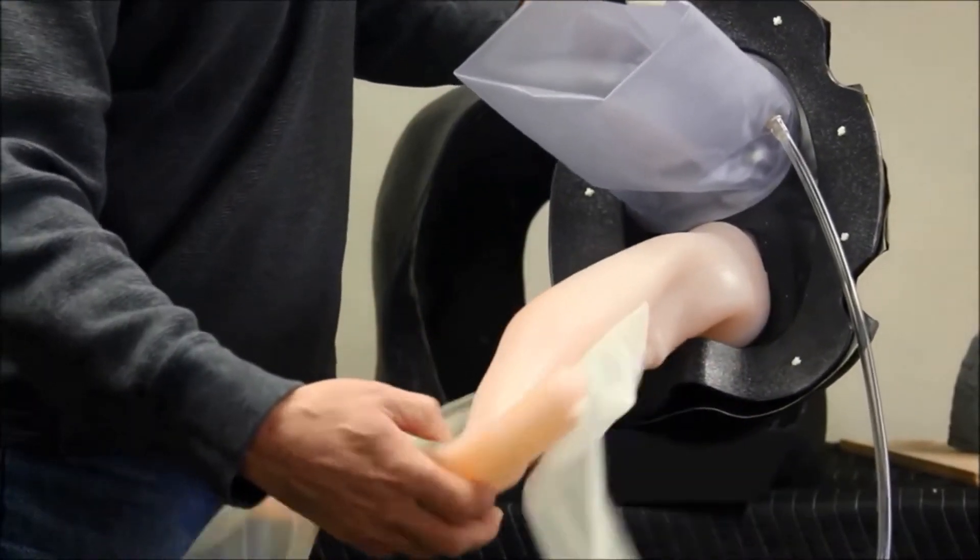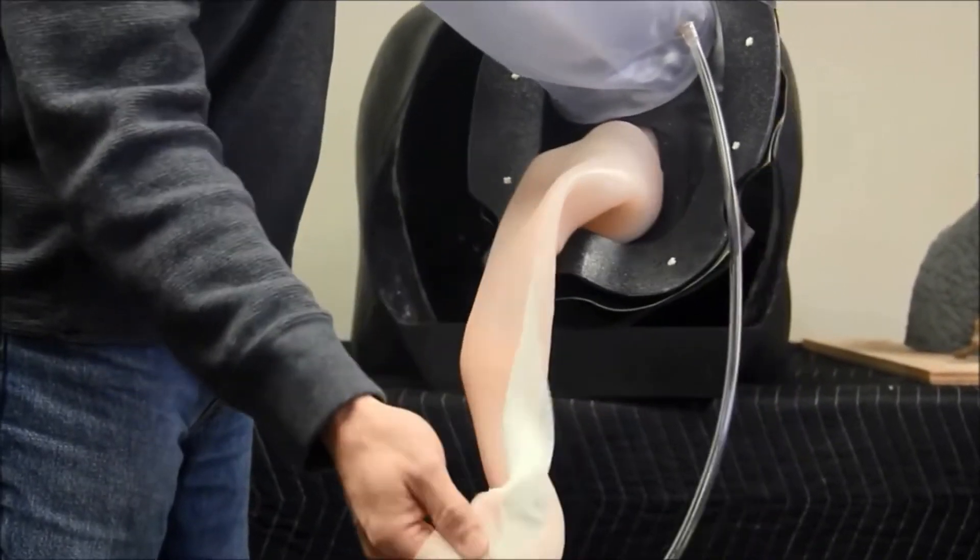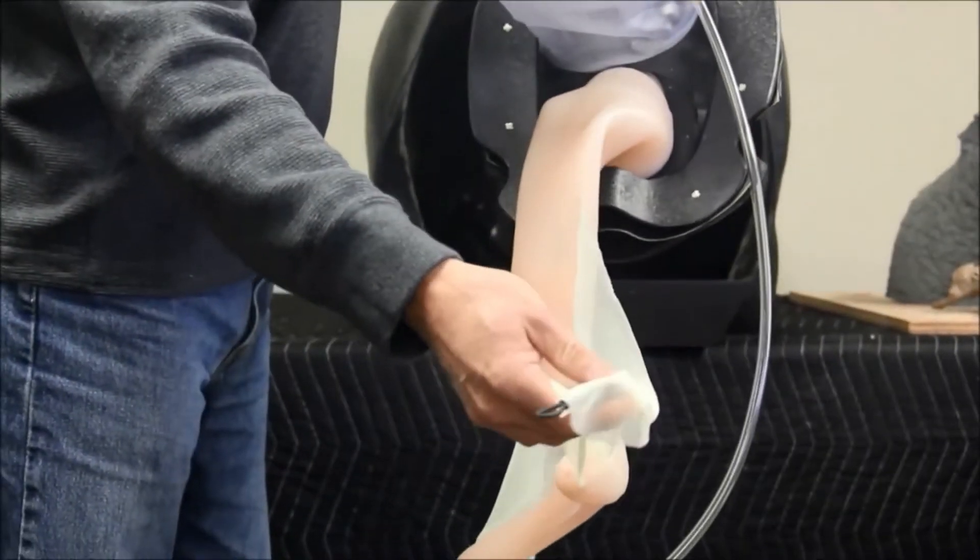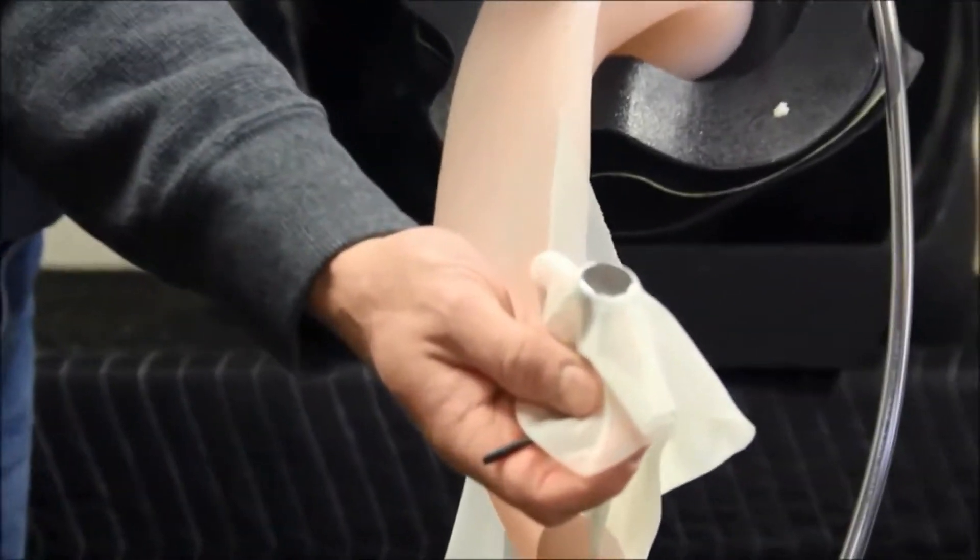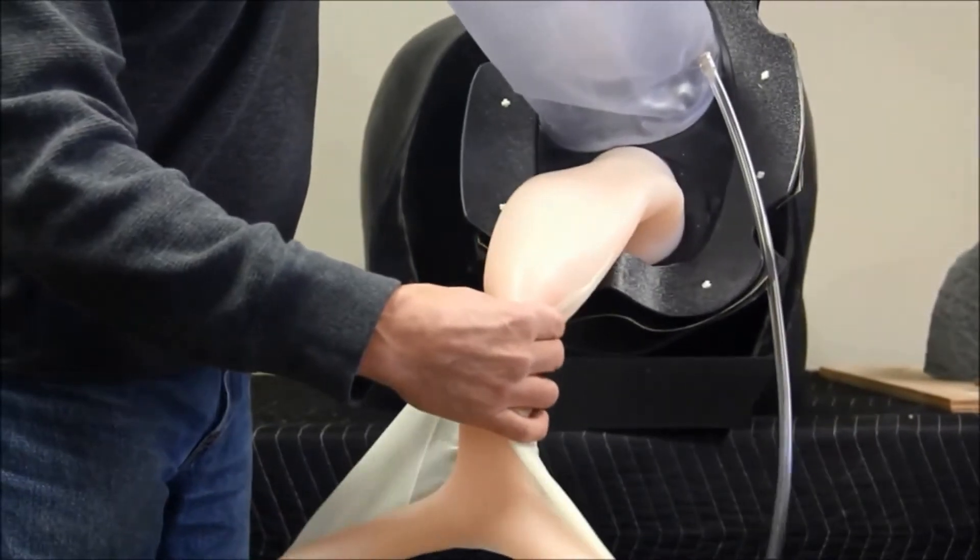This is the equine uterus. The ovaries are attached using these small openings at the end of the uterine horns. The broad ligament is represented by the fabric and mounts to the body wall with the attached magnets. It also has a palpable cervix.